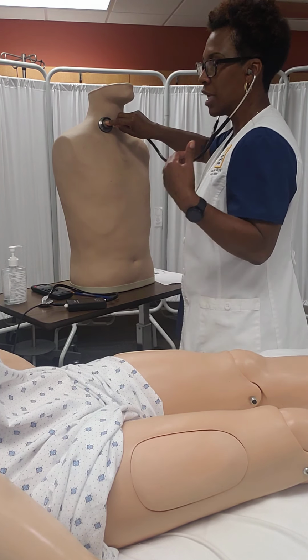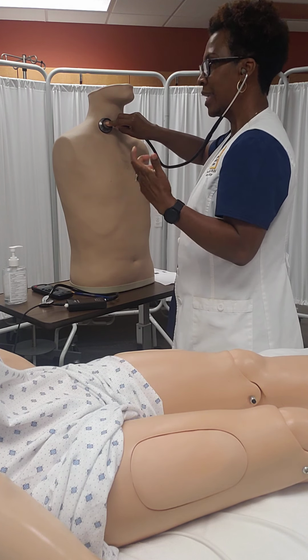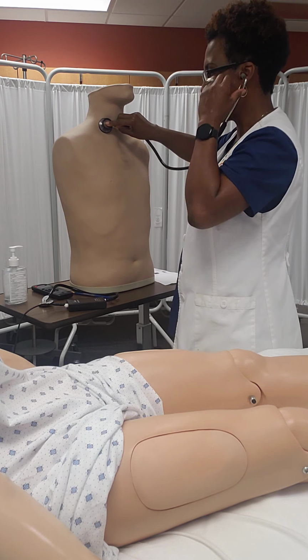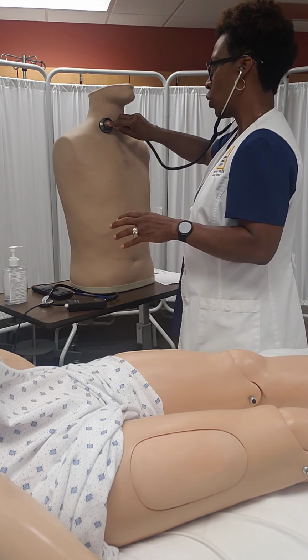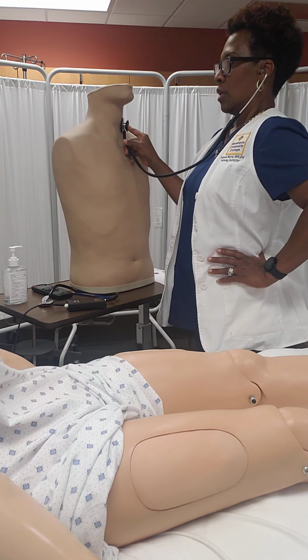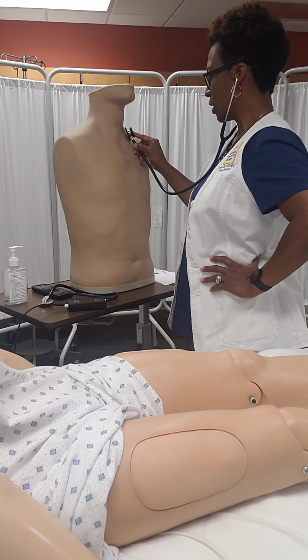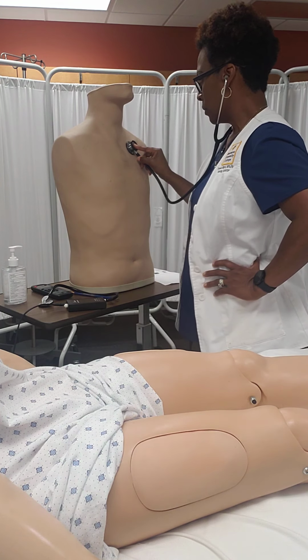We don't move our stethoscope until the patient has fully expelled the air out of their lungs. We want to be able to hear a full inspiration and expiration. So we move our stethoscopes again, and we just follow the pattern as you have on your PowerPoint presentation.